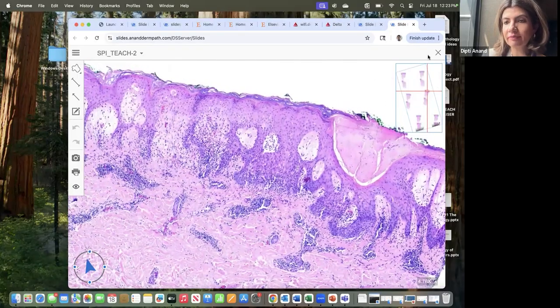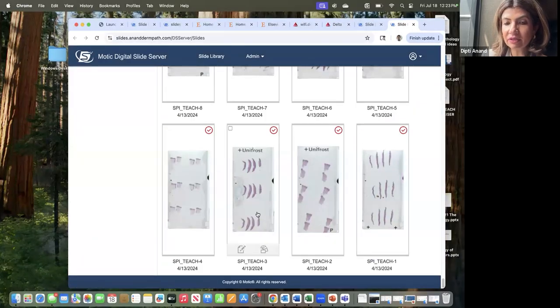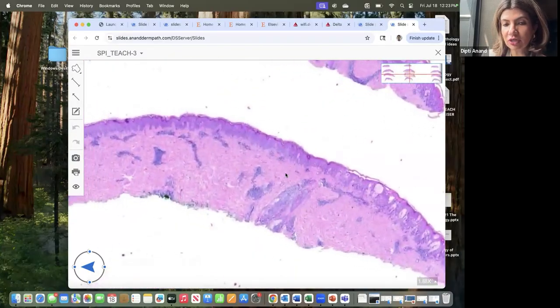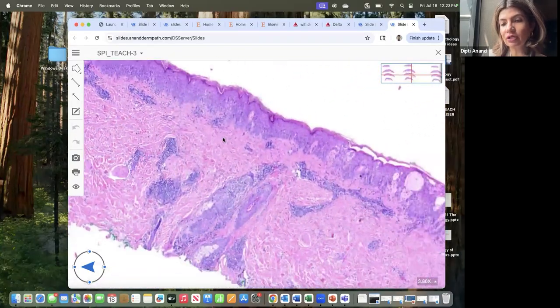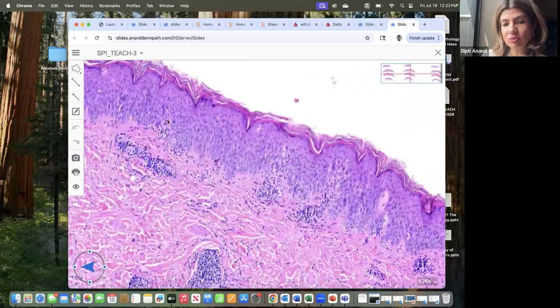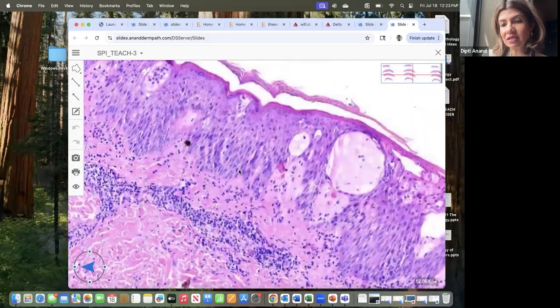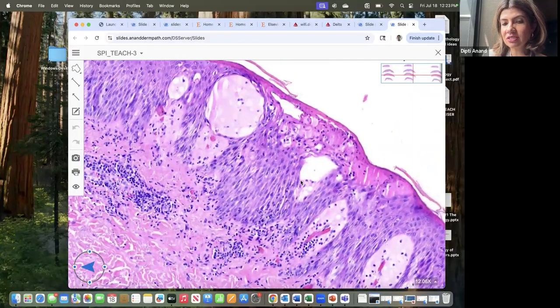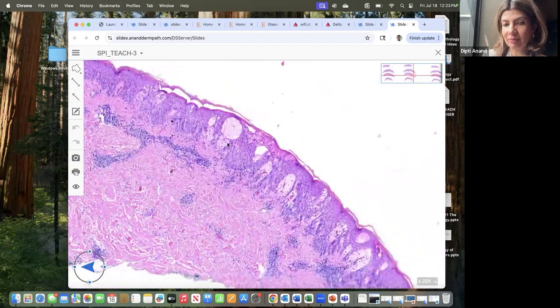That's acute spongiotic. Over a period of time, largely the inflammation would subside. So you get subacute spongiotic. So there are not any active blister formations, but you do see the crust, some microvesicles. There is inflammatory cell exocytosis. So this is a subacute spongiotic pattern.